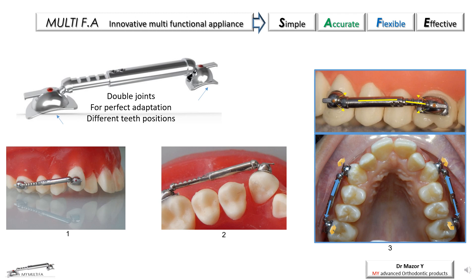The perfect adaptation of the brackets without the need to bend or adapt the appliance, or the need to compensate with a thick layer of cement, and in combination with the mesh pad, provides high bonding strength, increases appliance stability, and reduces the risk of debonding.